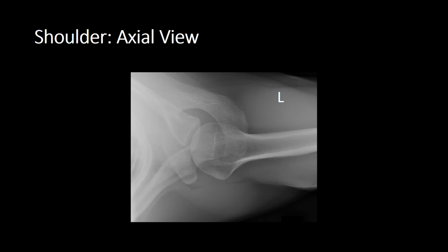The other problem with this view is that it can be very painful for the patient to put themselves into the correct position. So we'll now discuss the half axial view.